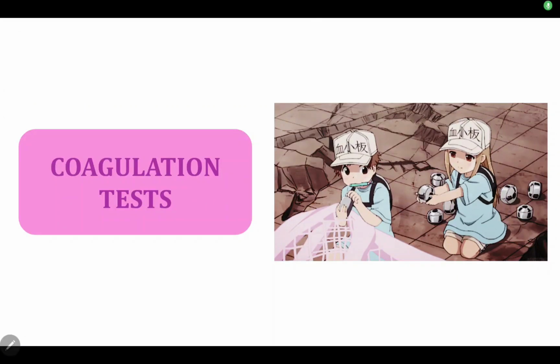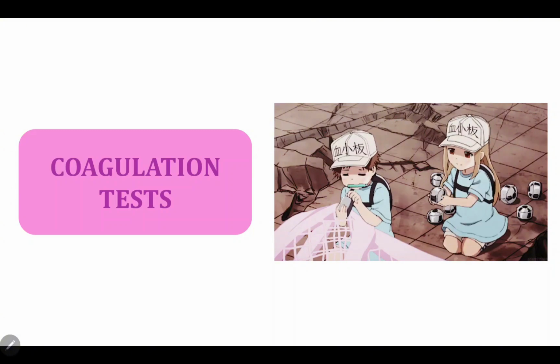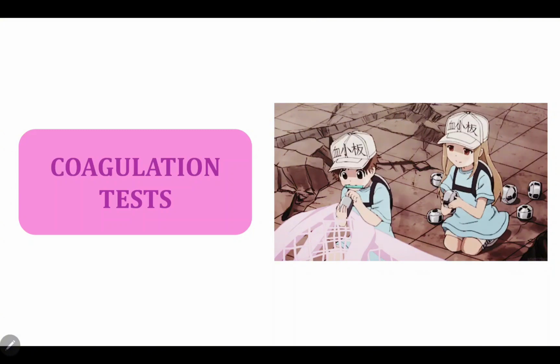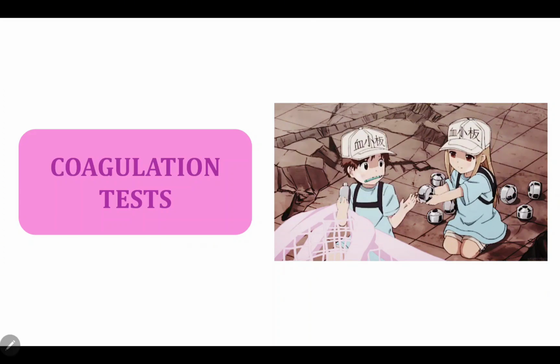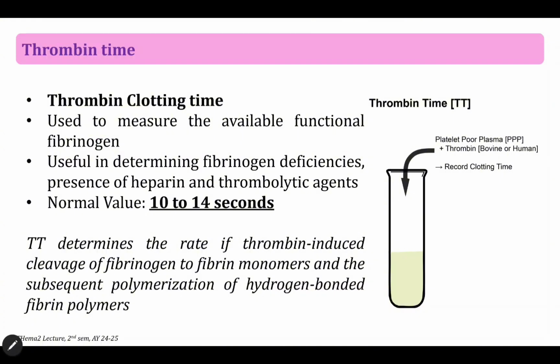Let's proceed now with your different coagulation tests. And again, we would only be discussing the tests that were not thoroughly discussed in the laboratory and may also be helpful to you in your upcoming cases. And one of which is your thrombin time. Your thrombin time is also known as your thrombin clotting time.